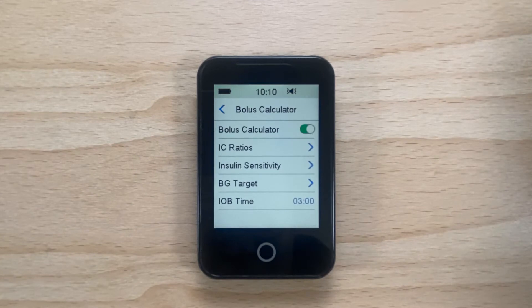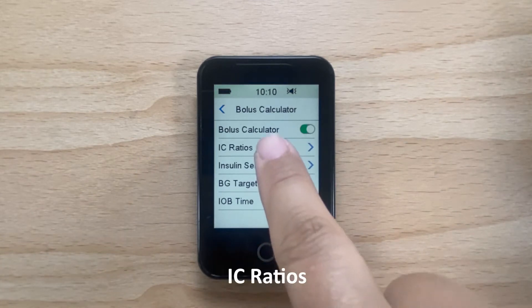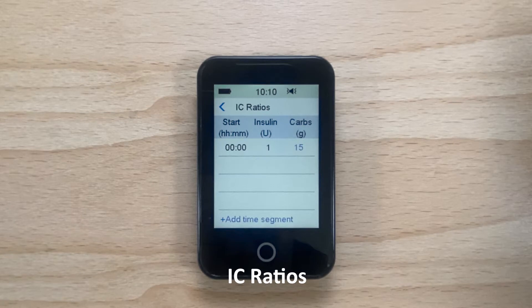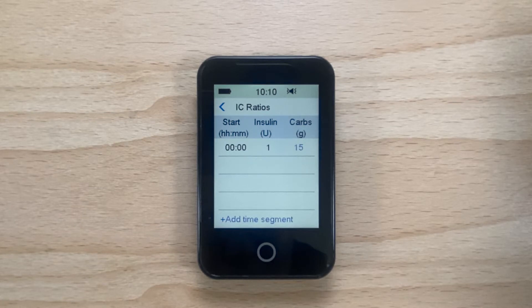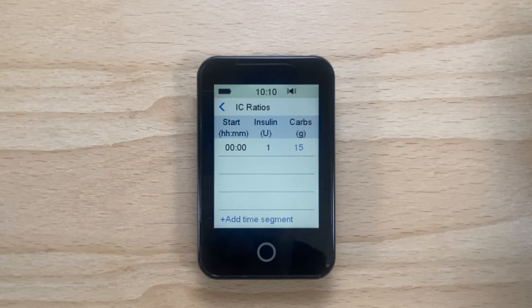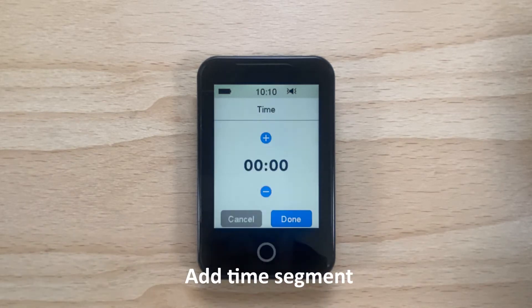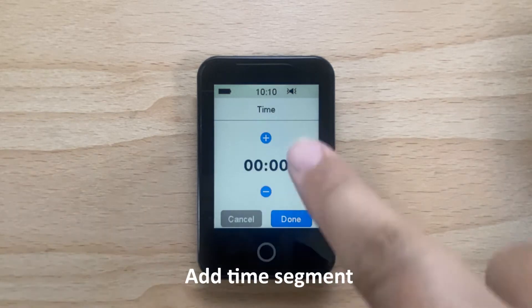Now you can set up your insulin to carbohydrate ratio for your pump by tapping on IC Ratios. You can add up to 8 different time segments for the day depending on your need for different ratios at different times. Tap Add Time Segment to add a new time segment.